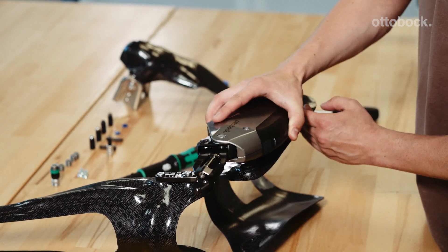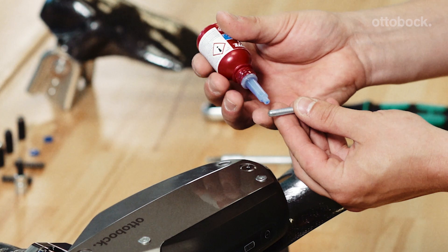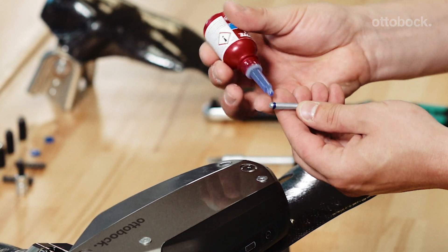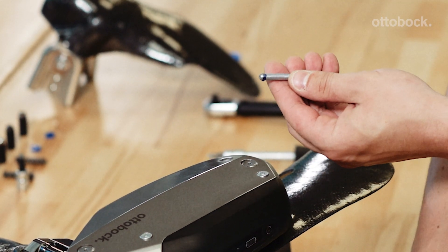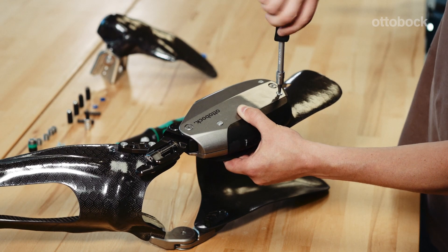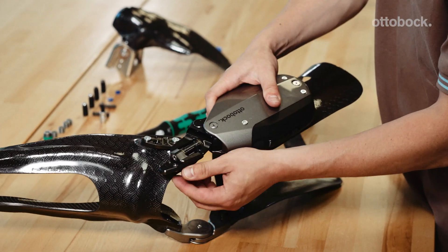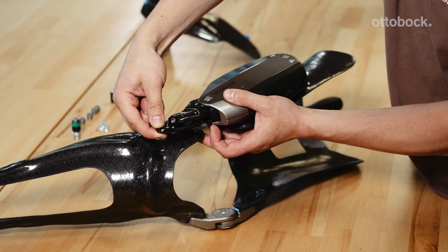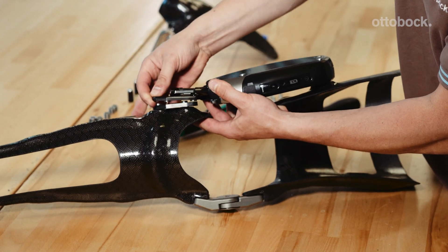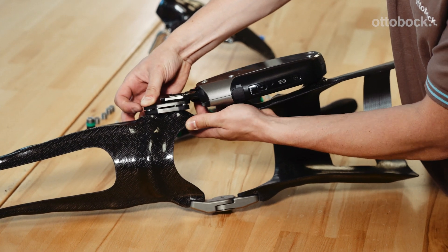Mount the C-brace joint unit on the orthosis shells. Secure the screws using a torque wrench and Loctite 241. Tighten all screws of the joint unit and adapter plate to 7 Nm. Tighten the screws of the medial support to 6 Nm.